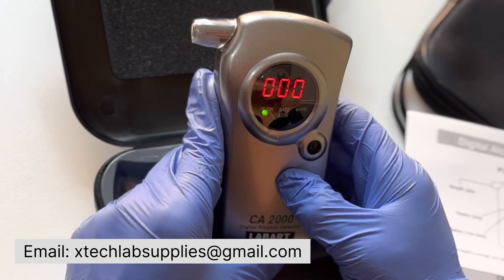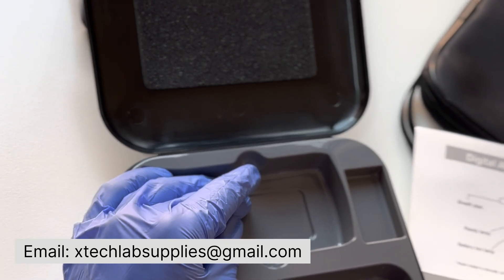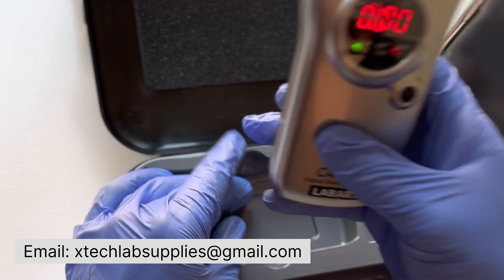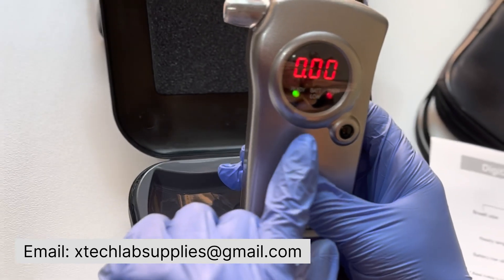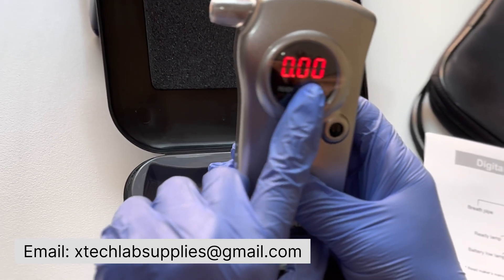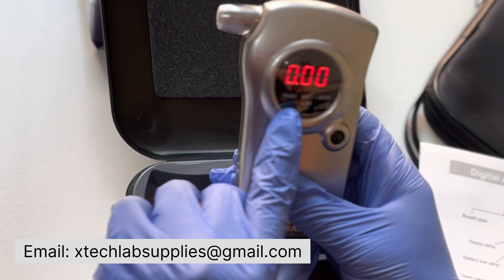Now the instrument is ready for testing. At this point, you will hear a beep sound. You can then blow into the pipe until you hear the beep sound again. The value on the display is 0.00%, which means you are in the safe range.